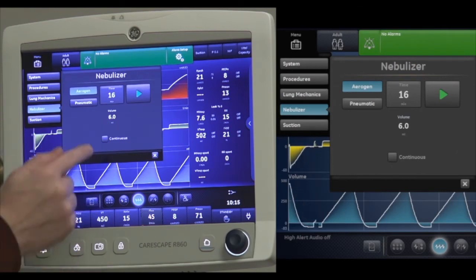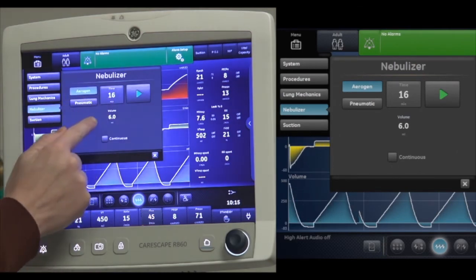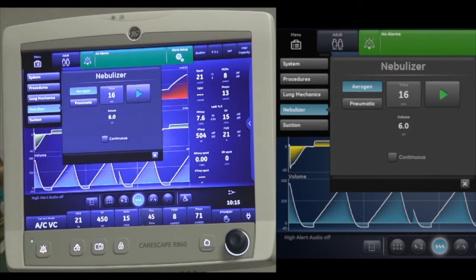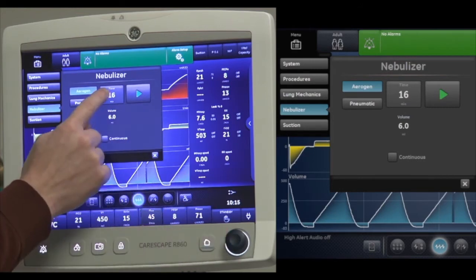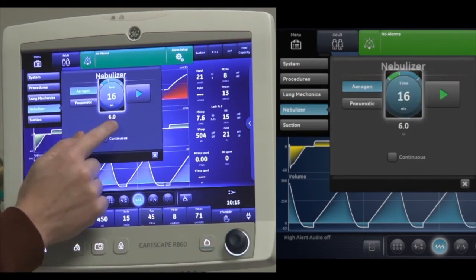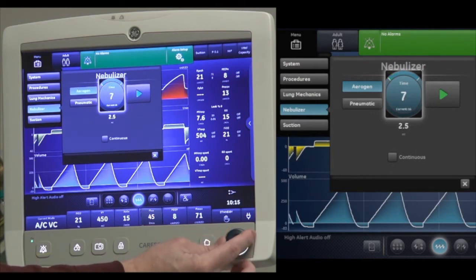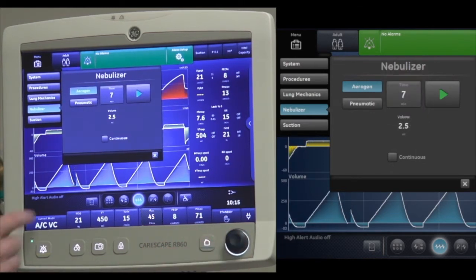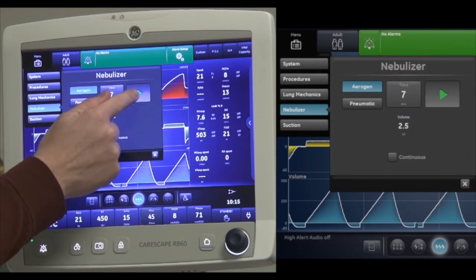Under Aerogen, you have the time of the treatment and your dosage. To change your dosage, you're going to manipulate the time using the trim knob. I'm going to select my time and manipulate the trim knob, changing it to 2.5 as the dosage I want to deliver. Once my dosage is correct, I select the start button and this starts my treatment.